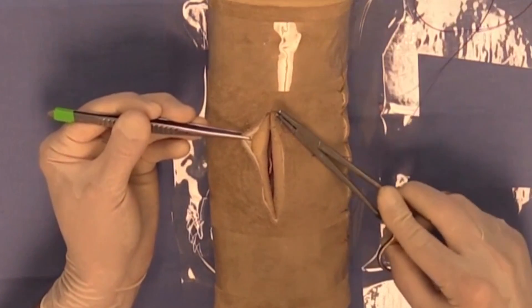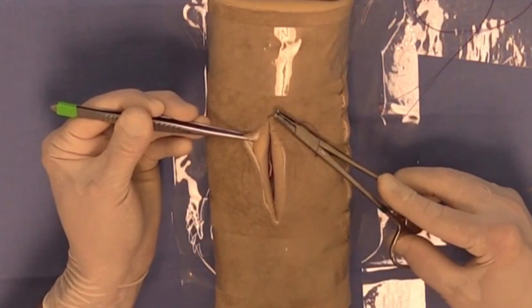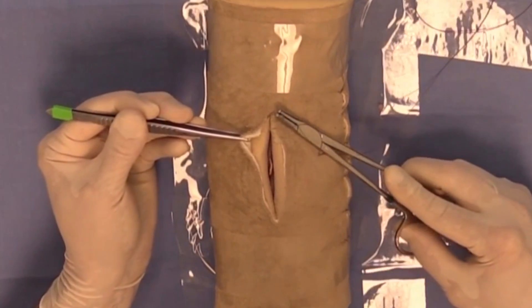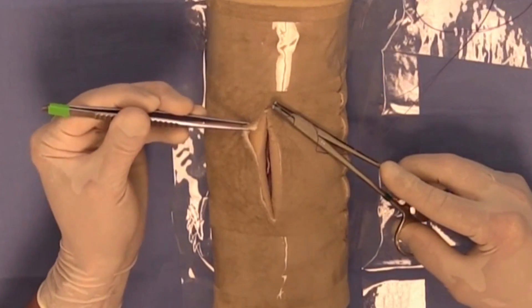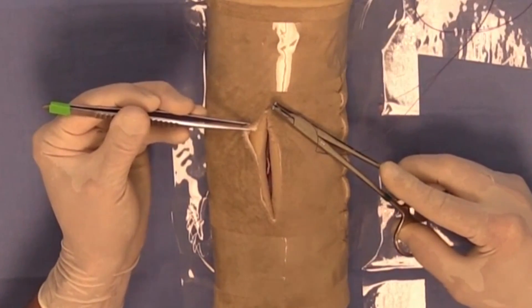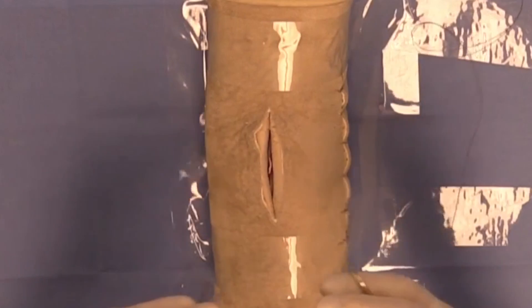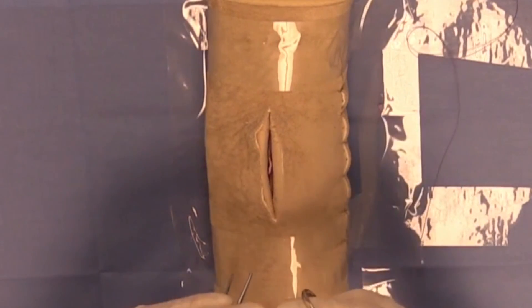It's really hard to engage the deep part of the dermis on the DAISY. A subcuticular pattern is one done very close to the skin edge in which you engage the dermis in order to bring the skin edges as close as possible together.